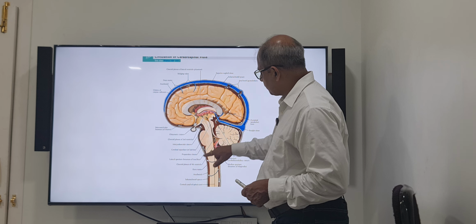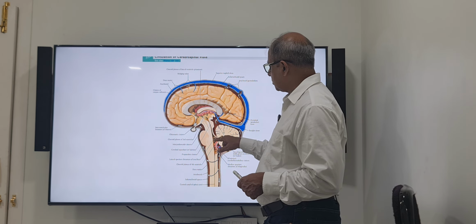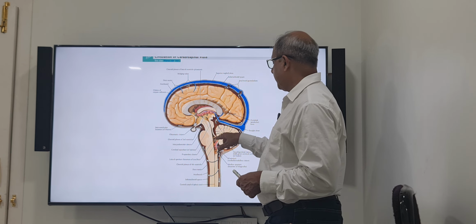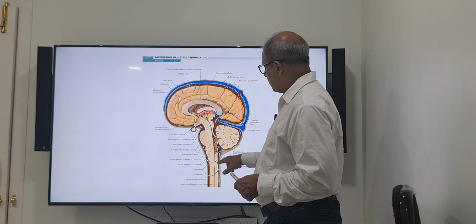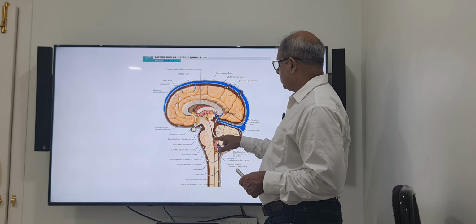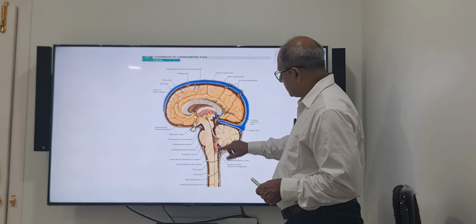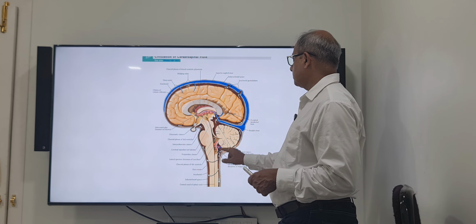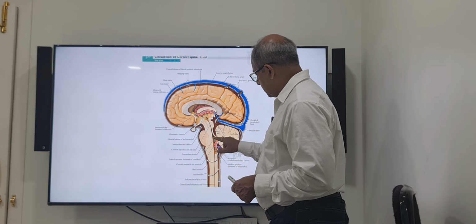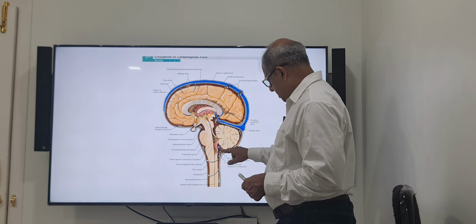And you can see there are foramina, which are orifices which give the place to depressurize the CSF fluid into the outer part of the neural tube. The outer part is external to the neural tube, through the foramen of Luschka and foramen of Magendie. You see the Magendie is placed below the cerebellar hemisphere, and this is the fastigium. This is the top area of the fourth ventricle.